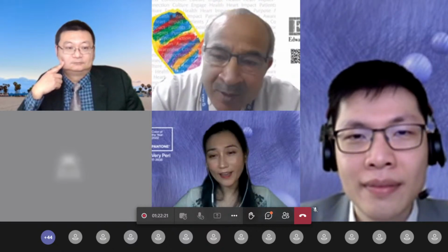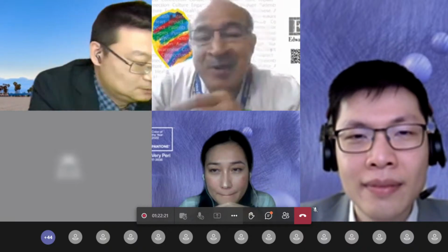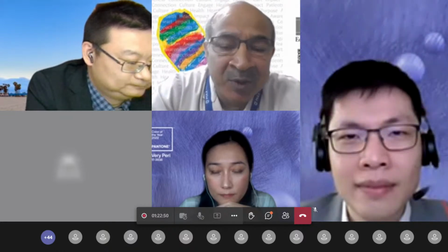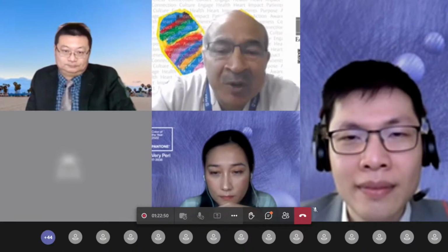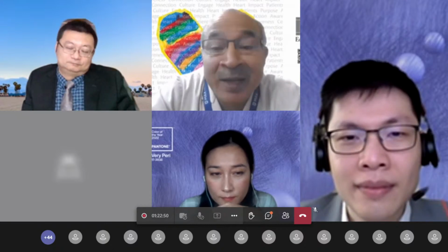So we use less. We reuse. It's a public-private admission that I reuse. The only problem with reuse is that these are such sensitive monitors that reuse will decrease their sensitivity, and the numbers which we read, that meaning may be lost. So it's a gamble.